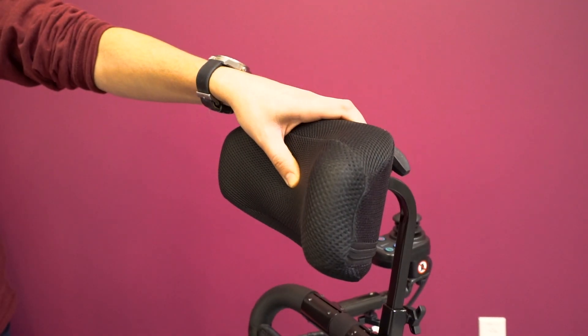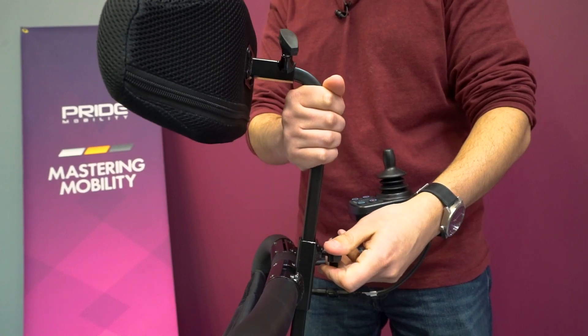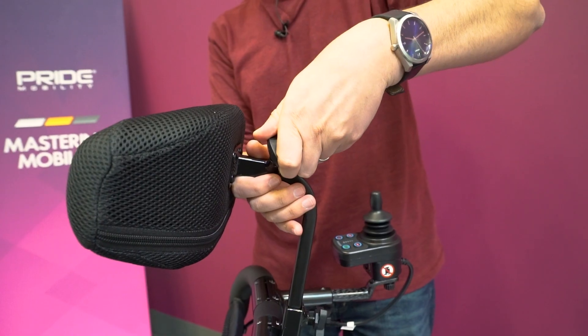First, we've incorporated a padded headrest to the Jazzy Carbon to provide users with extra support. This headrest has height and depth adjustability to ensure that anyone can enjoy a more comfortable ride.